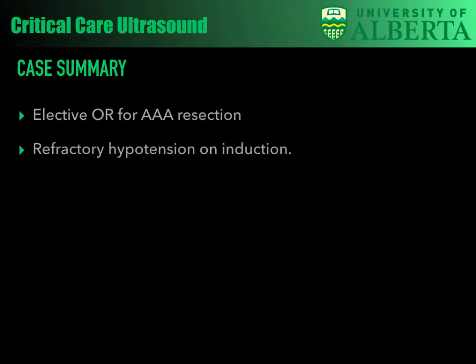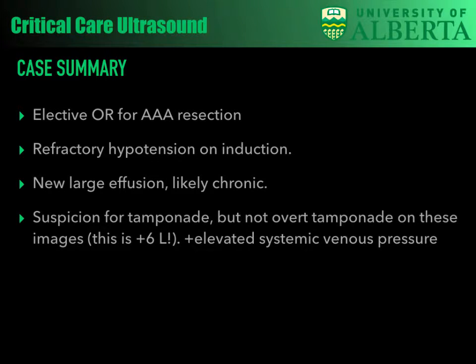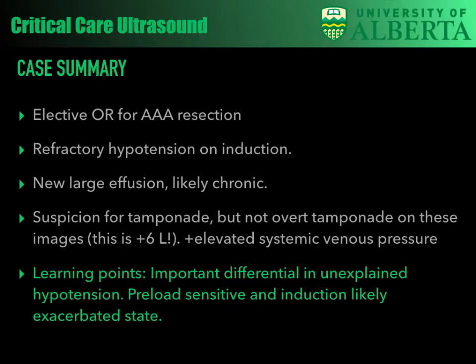So the case summary of this one is really, this is a likely chronic effusion. It's obviously quite large. It's been there for a while. She was still going for an operation. She dropped her preload, likely with some induction, and that was enough to cause the manifestation of tamponade.